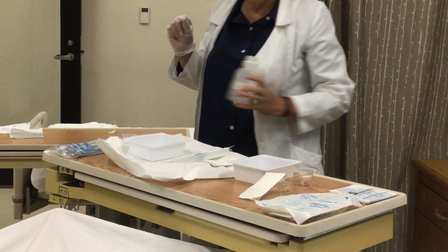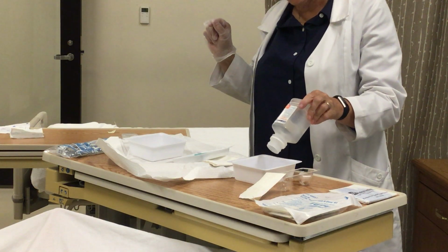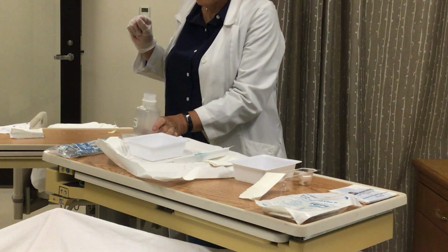So I'm going to pour my solution, and this is normal saline. For today we are pretending. Okay.